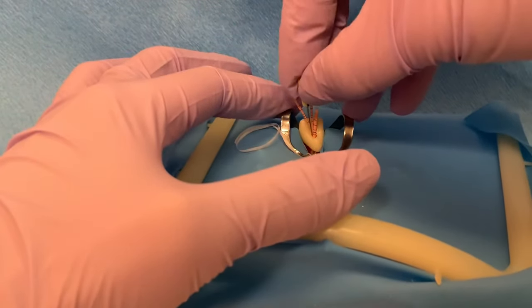Even the smallest size accessory cone would not fit in the canal, so we removed that one and this is where we stopped. For this step, prepare your torch and the endo plugger. Using the torch, heat up the endo plugger until it is cherry red. The heat will transform the gutta percha to its alpha state, which is pliable and tacky. Take this carefully to the tooth and sear off the excess gutta percha above the level of the orifice.